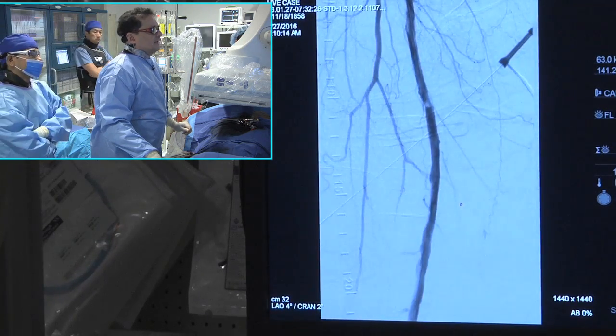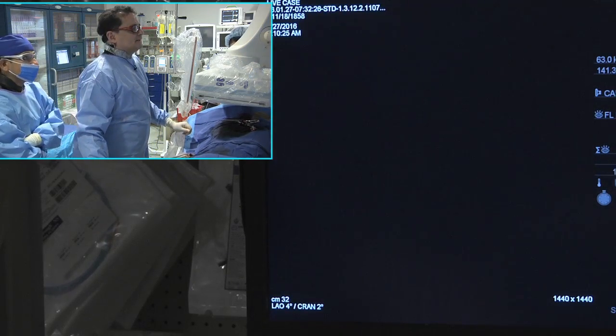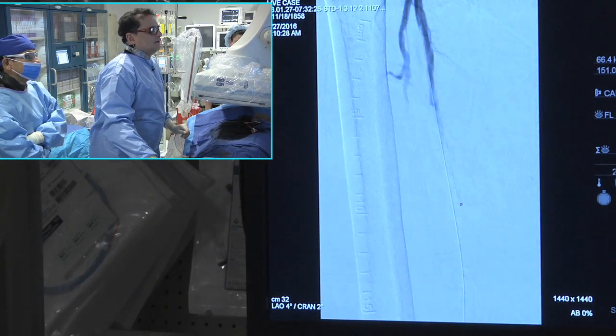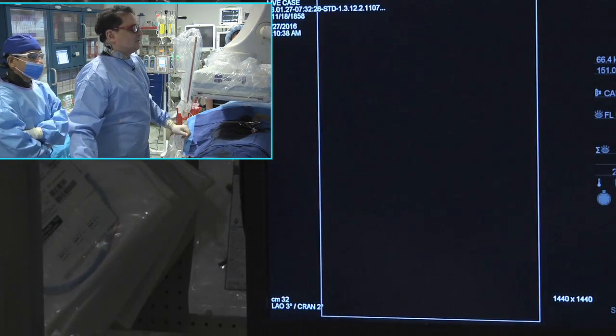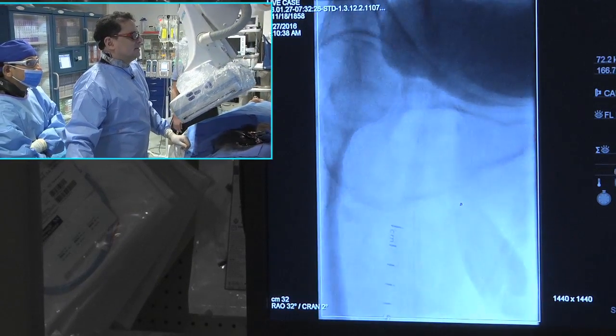So it's really just, honestly, very focal. DCB, it's a focal Supera, but I want to look above this just to see what's going on here. You could argue to leave it, man, but I don't know. I mean, that one area is pretty nasty. I don't like, yeah, exactly. That one area, you can even put a shorter stent, but let me just see the ostium as well here.